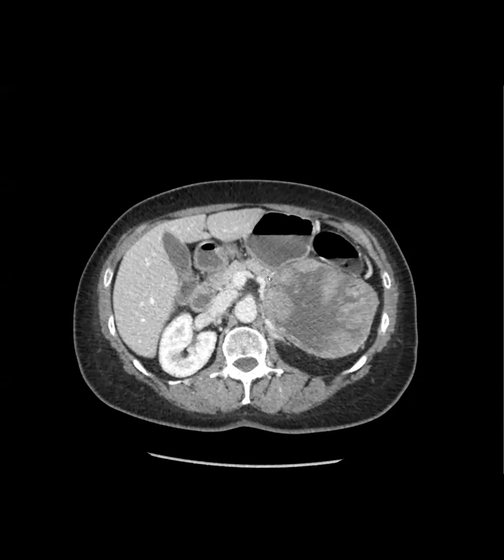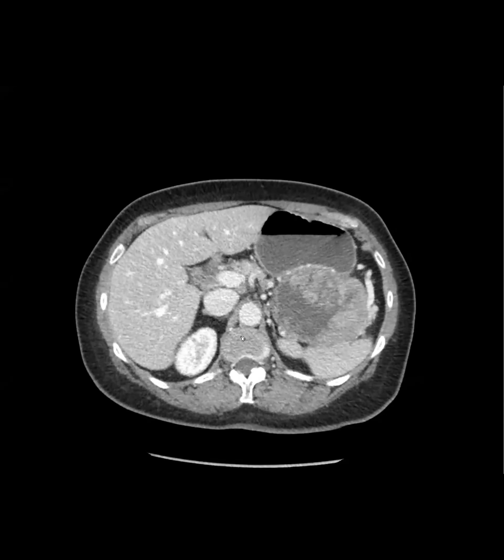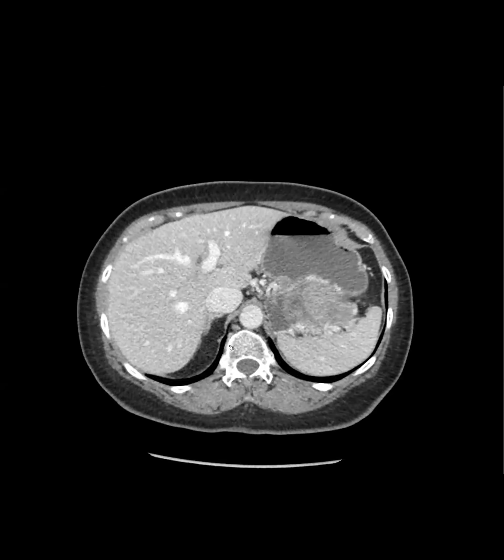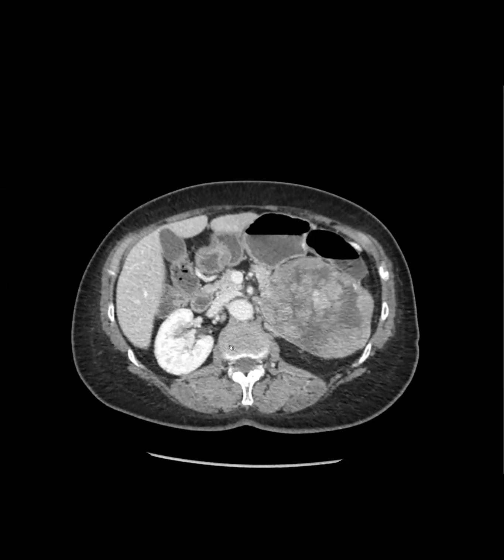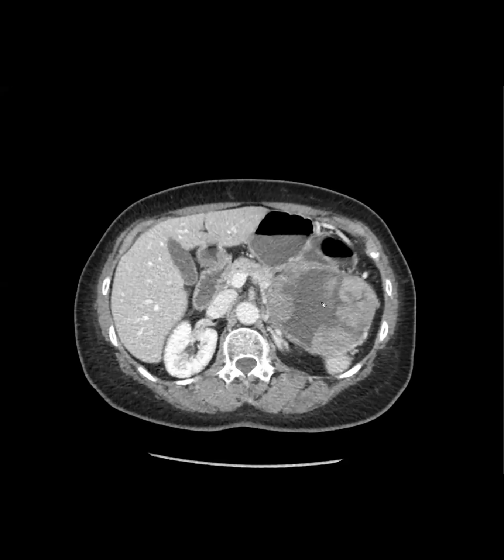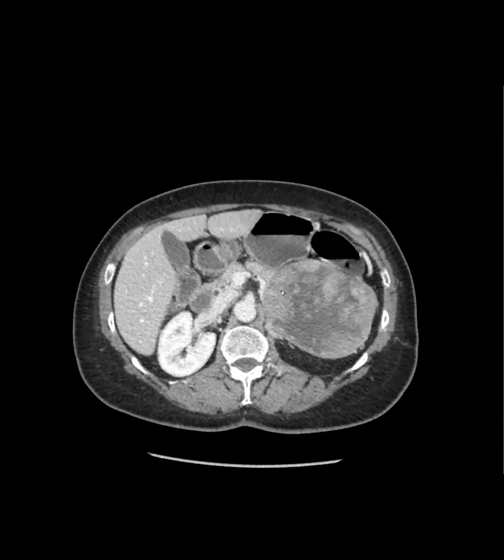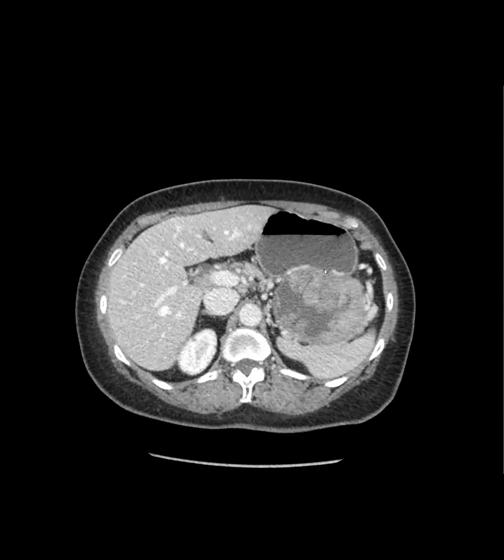So the pancreas is here. Could it be SPEN or whatever it's called now? Is it called something different? I think so. I think they changed the name from SPEN to some other acronym. Okay, so SPEN's a great thought, solid pseudopapillary neoplasm, and they could have solid peripheral parts with internal hemorrhage. And then GIST is also a great thought. It looks like it's affiliated with the stomach.